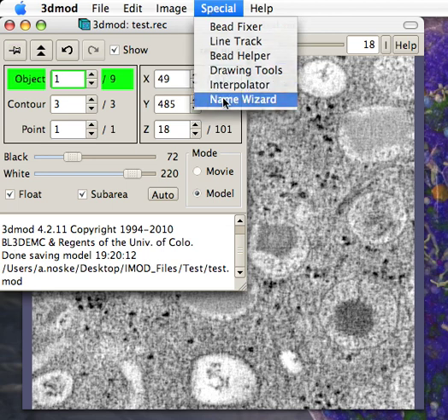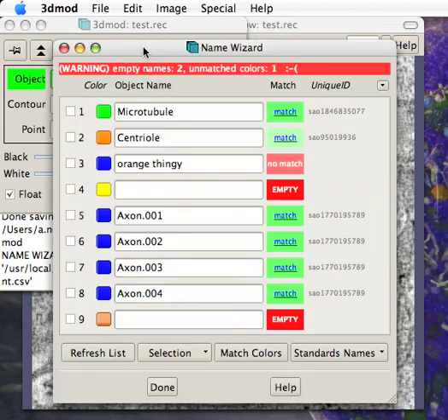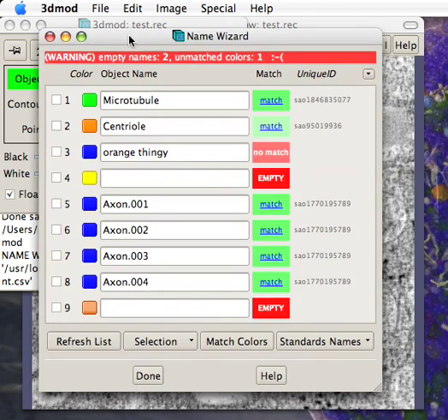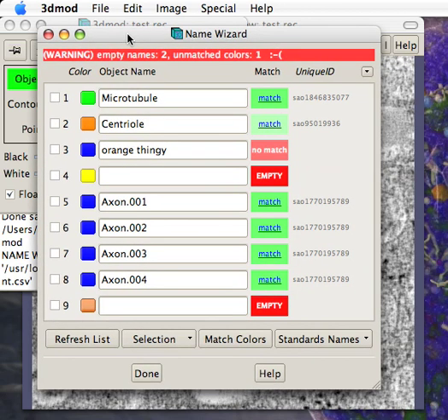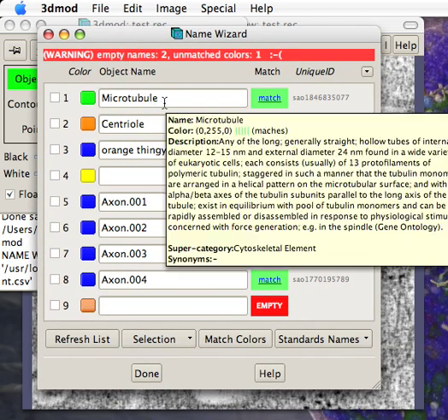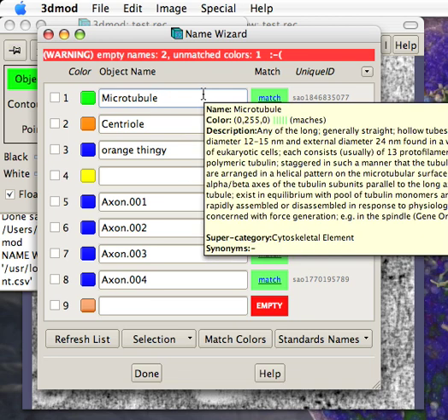It's called Name Wizard. It might not be part of the standard iMod release until mid to late 2011, but you can get it in the alpha copy. The plugin shows all your object names and matches them to tell you if they're proper or not. For example, microtubule has been matched with a database entry.